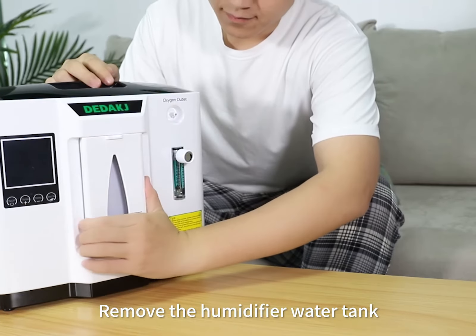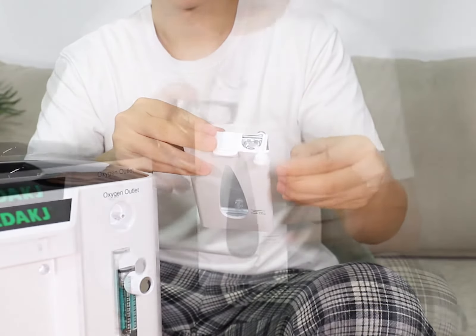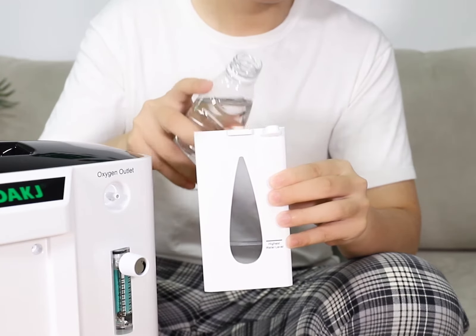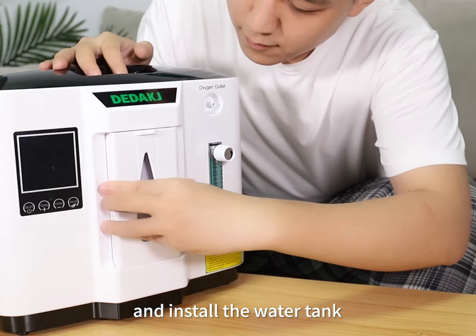Remove the humidifier water tank, open the rubber stopper, and fill the water tank with clean water. Plug the rubber stopper and install the water tank.